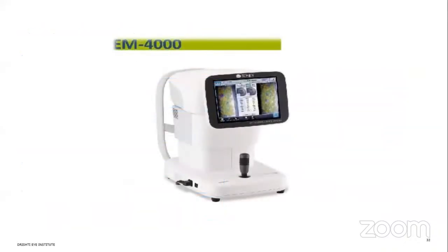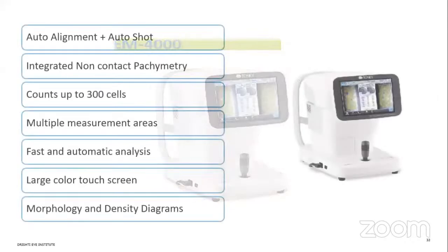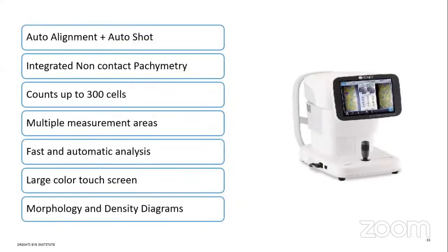The special features of the EM4000 Tomey used in our setting are that it has auto alignment and auto shot, and it has integrated non-contact pachymetry, which can measure the corneal thickness, as I said, and it can count up to 300 cells per frame. It has multiple measurement areas, which I'll be showing in the subsequent slide. It is very fast, and also has a large color touch screen, thus producing morphology and density diagrams in the printout clearly.